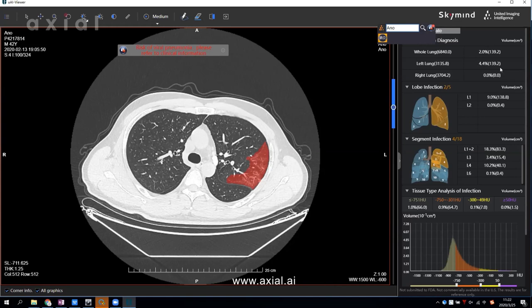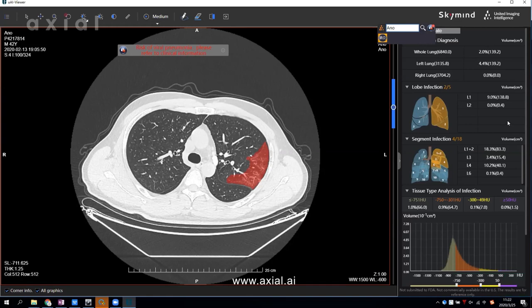The measurement can go down to lung lobe level. In this section, you will see the infected lobes, with the percentage and volume of each lobe. In this case, only the left lung lobes are infected, so Axial AI only shows L1 and L2.